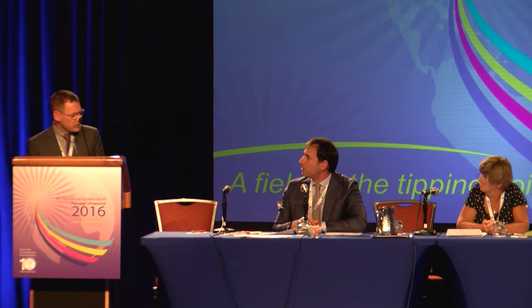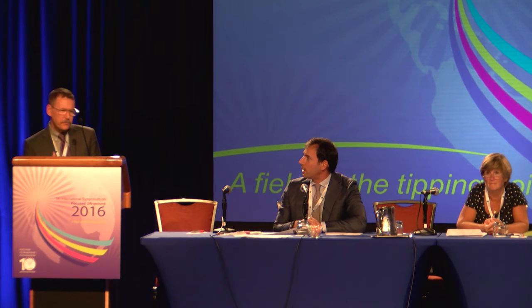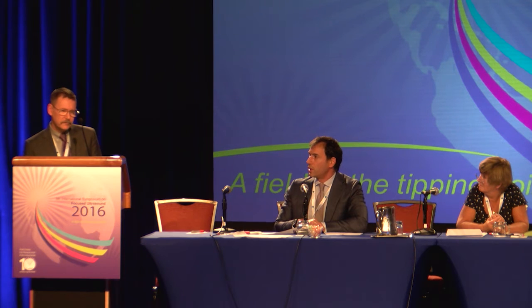I do have a quick question. The case that really didn't want to respond, even with high power, looks very much like the one I presented, because it's totally detached from the cortical space. So an intact cortex means not very much penetration of the energy, probably. Exactly. And looking at it, the cortex actually looked a little bit thinned out, so we were hoping that we'd get good penetration. She did have some response to it, but it wasn't enough. Yeah, we need to find a way to get the energy over there. Yeah, and I hope that maybe lower frequencies or something will help us. Or even longer sonication, much longer, probably.